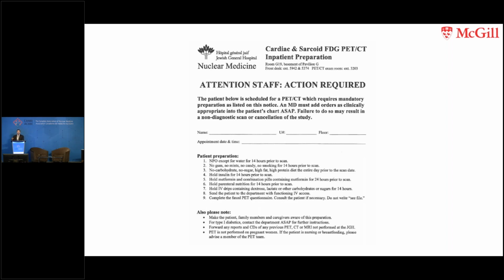So what we do is we have a protocol, and we make sure that the patients, and especially the inpatients, the nurses, everybody has to know about it because they're injecting glucose for a variety of reasons. So it's not only just following the diet, but everybody needs to be on board and follow the protocols strictly.